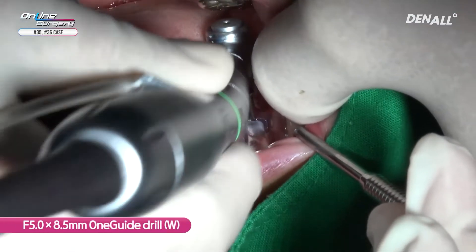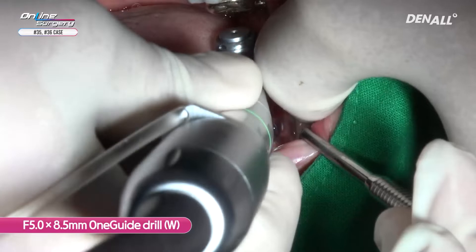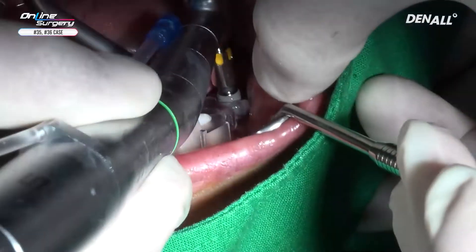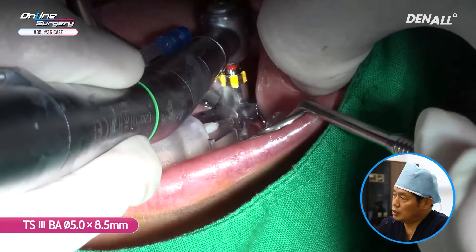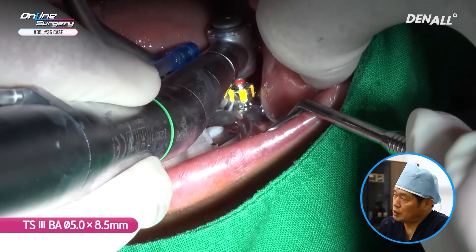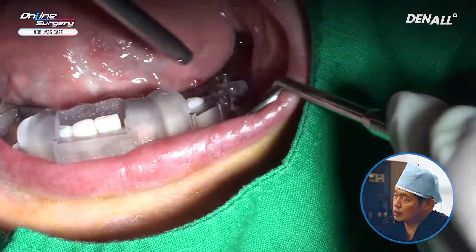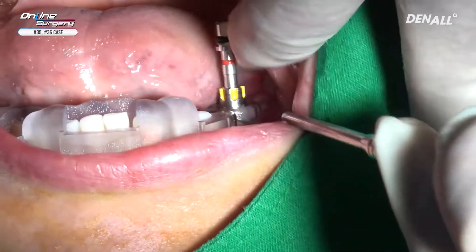We are almost there. As mentioned earlier, considering the patient's level of mouth opening, I decided to place the 8.5mm implant.